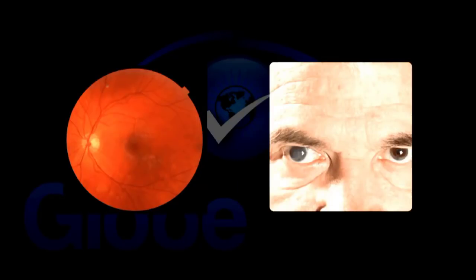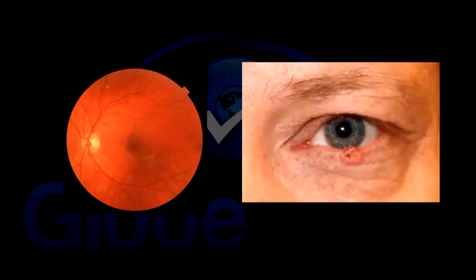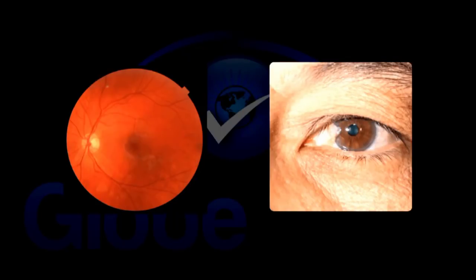This patient has a normal fundus photo, but has an obvious ocular problem on the right, a cornea problem and a cataract that is misdiagnosed and undiagnosed. This patient has a large cancer on their eyelid that we didn't pick up. This patient has a pterygium and possibly a squamous cell carcinoma on their eye that we didn't pick up by fundus photography.